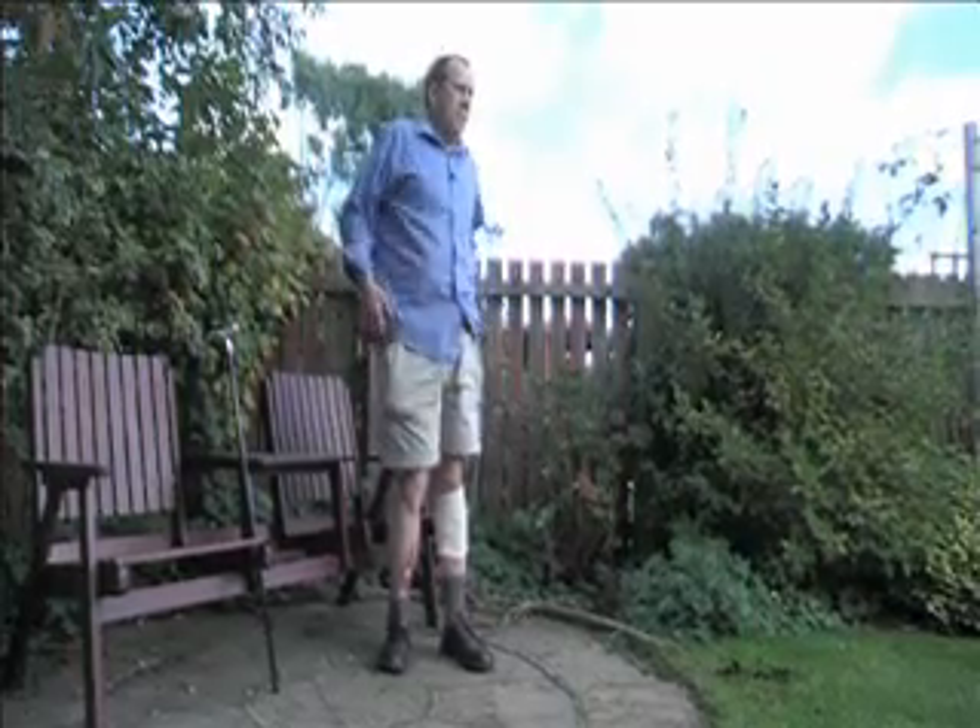When Graham first walked with the stimulator, he couldn't quite believe that it was as easy as it was for him. But this is not what happens to all our patients, so it's very important to match our expectations and to treat our patients as individuals, assess them as individuals to see whether this treatment modality would actually be suitable for them. ODFS works by stimulating the nerve superficially on the lower leg and it allows muscle activity to lift the foot, which helps swing the leg through in walking to make walking easier.